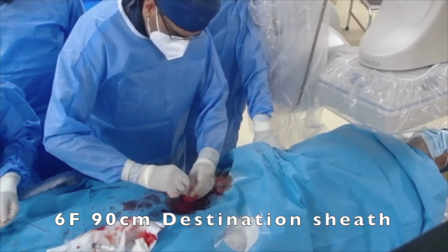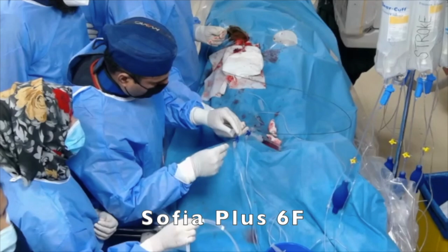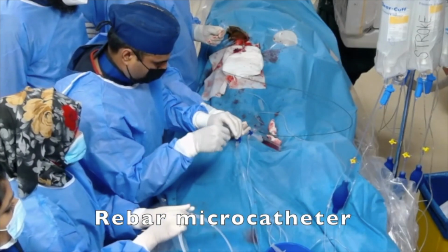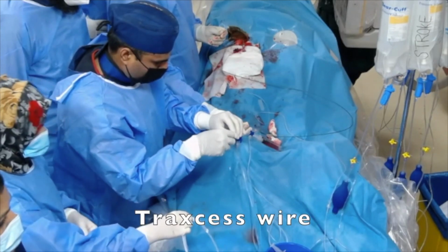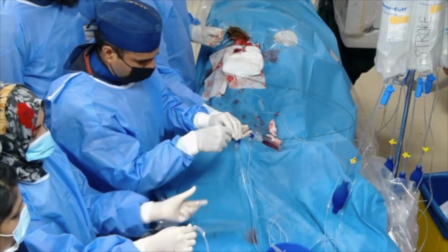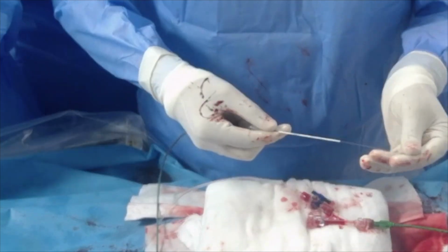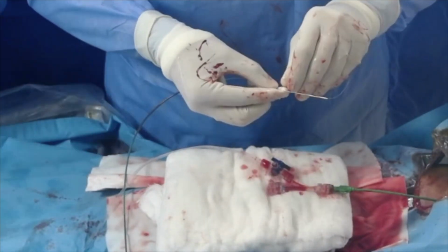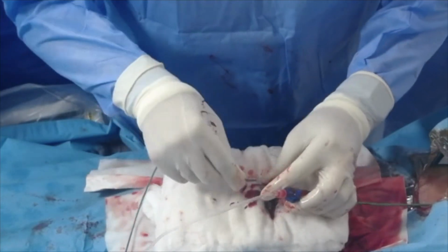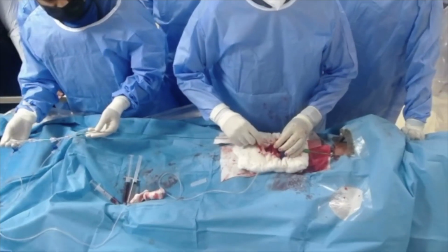At the time of this procedure, we were out of stock with the balloon tip guide catheter. Sophia Plus 6 French with Rebar microcatheter and Trexus wire taken together as one unit through destination sheath. Sophia, destination sheath and Rebar microcatheter, all three were connected with Y connectors and flush lines. As continuous flush is going on throughout this procedure, there is no heparin or antiplatelet on board.